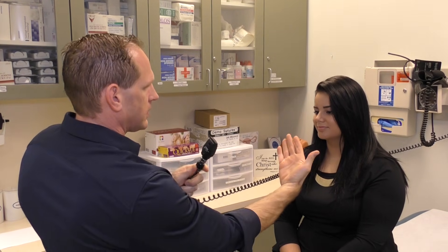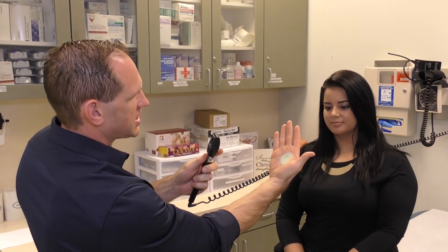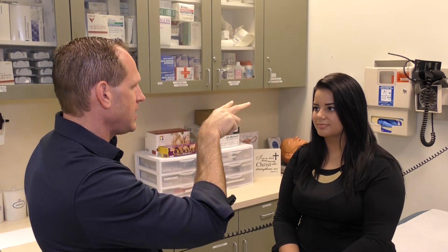Next we can take an ophthalmoscope. The bottom collar controls brightness — you typically just want the brightest setting. The little lever changes the shape of the light; we just want the big circle. Stand back, shine it in the patient's eyes, and look for where the light reflects off the cornea — this is known as the corneal light reflex. It should be in the exact center of the pupil on both sides. If it's off to the side on one eye, that's a sign their eyes are not converging together, which may indicate a lazy eye, wall-eye, or cross-eye.